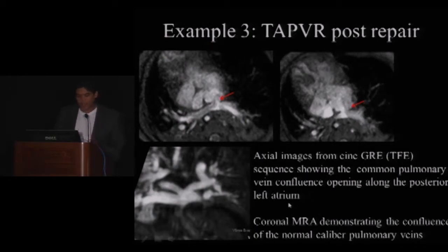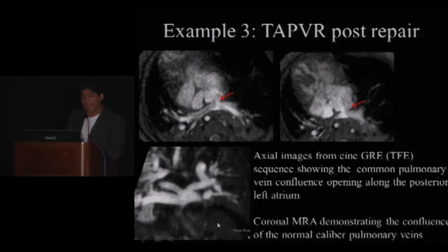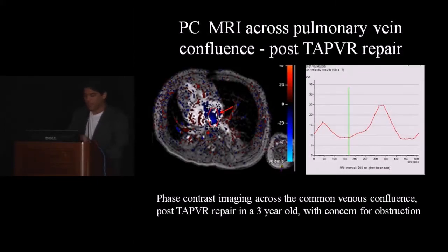We receive many referrals for post-repair total anomalous pulmonary venous return evaluation. An axial stack of spoiled gradient echo bright blood provides excellent contrast between the blood pool and vessel walls, allowing assessment of the confluence and its opening along the repaired TAPVR posterior to the atrial chamber. The MRA also complements the bright blood technique, demonstrating normal caliber veins and the confluence. Phase contrast can document flow across the confluence and provide a gradient from the velocity obtained.